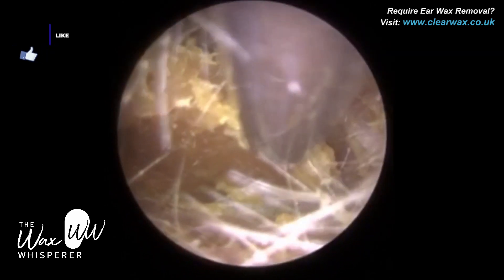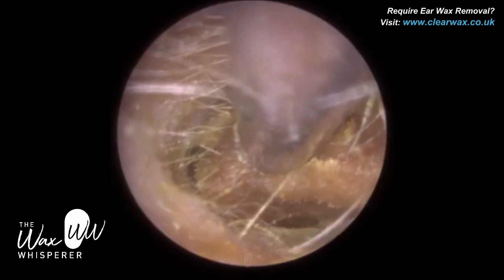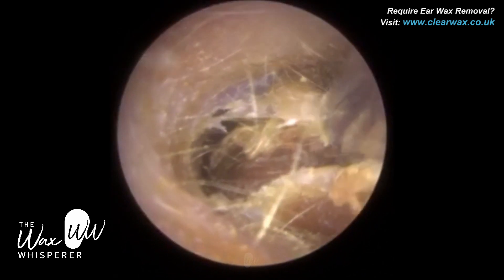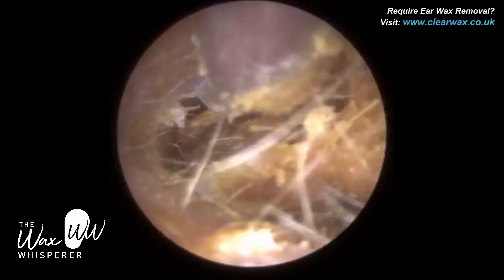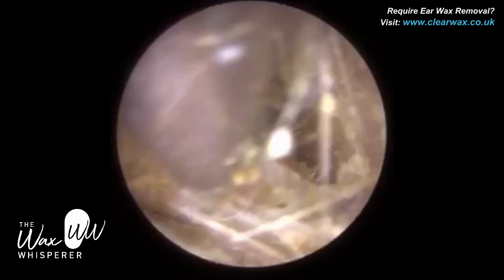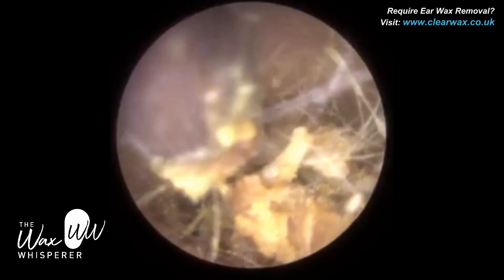In this particular case the patient's otitis externa is just causing her some itchiness and irritation. I'm just using the Zolymar suction probe and I'm trying to detach this plug of wax and dead skin off the ear canal wall. You can see it's quite dry here at the roof of the ear canal where the suction probe is. You've got some keratin there as well — dead skin — and it acts like a double-sided sticky tape in the ear. Not only does it stick to the ear canal wall once it's died and shedded, it can also attach itself to the outer layer of the ear wax and tries to stop the ear wax from being removed.